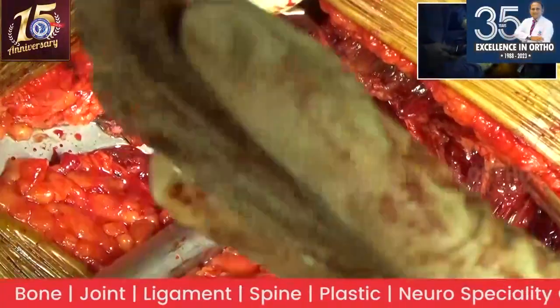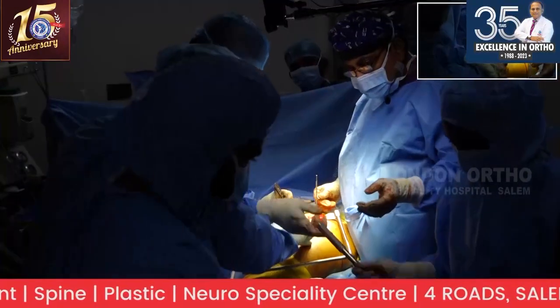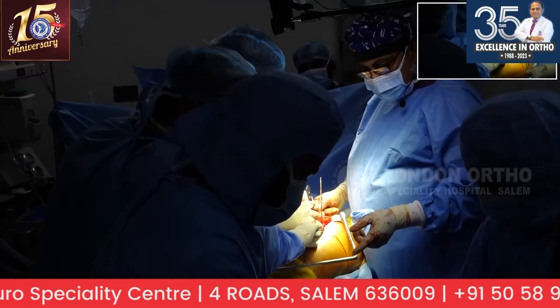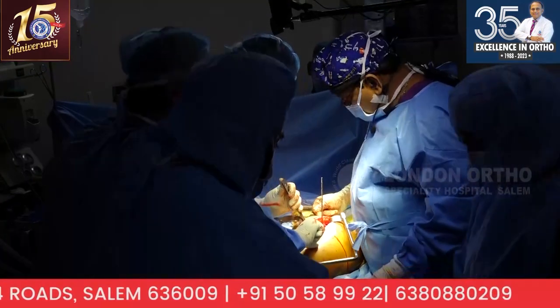So either I can go a bit smaller size and try that, and come back. Particularly in this medial wall break, 46. Wash.